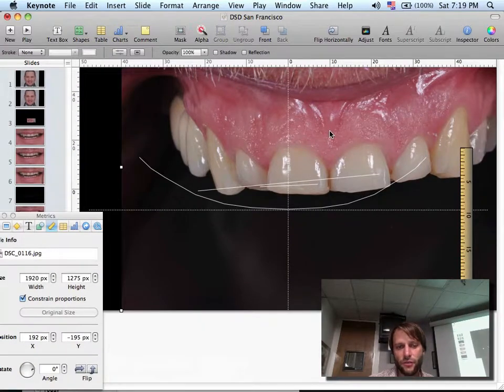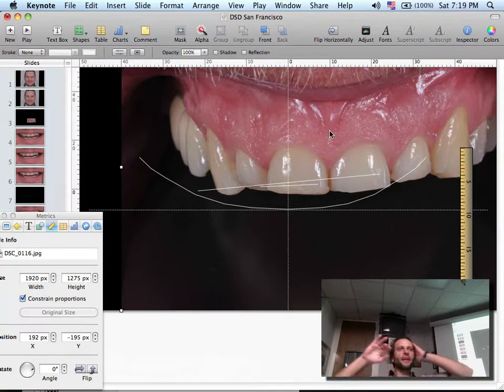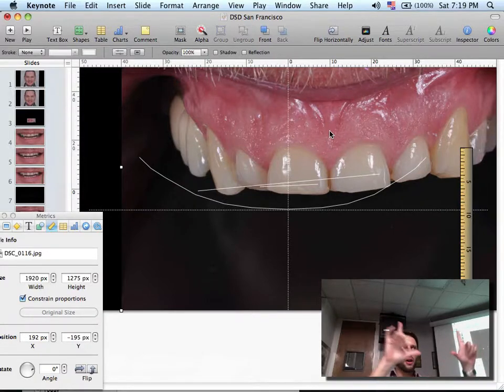And then after I do that, I have to calibrate. There's four things that we have to calibrate. Imagine that we want to place this picture on top of the face picture, and we want to move it and resize it to make it match as best as possible, remembering that they will never perfectly match because of the difference in the angle of the pictures. So if you match the cuspids, you won't match the centrals. If you match the centrals, you won't match the cuspids.